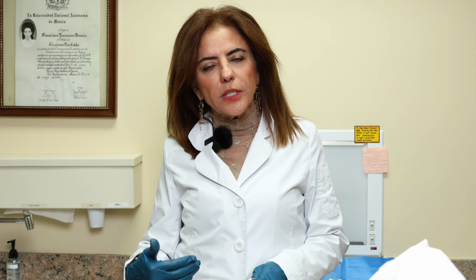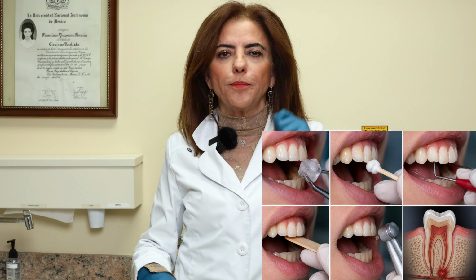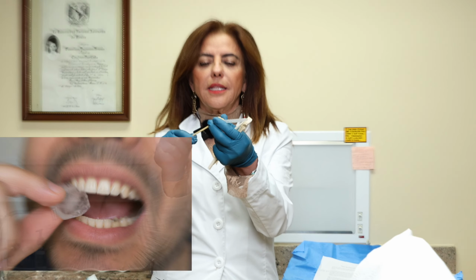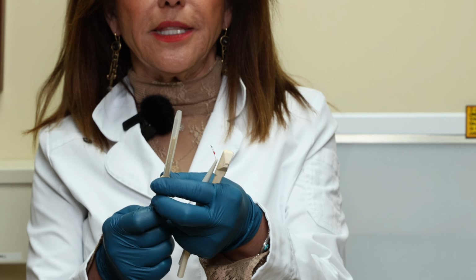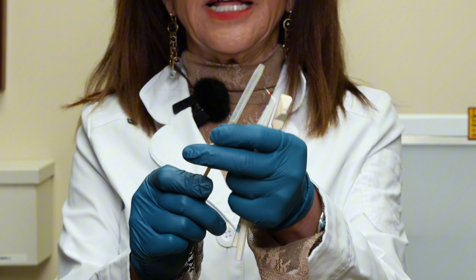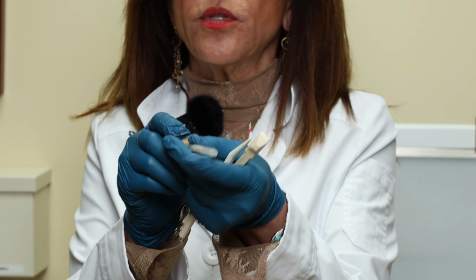When you come to the endodontist, we're going to do different testing: cold, hot, sweet. We don't do the sweet test, but we do biting. We check the gums. We check the cold. The cold test is done with this small device that has a circle also covering. I don't know why there isn't something different yet, but the dry ice goes all over in this container, and then we start pressing. The ice starts coming, and we go tooth by tooth.